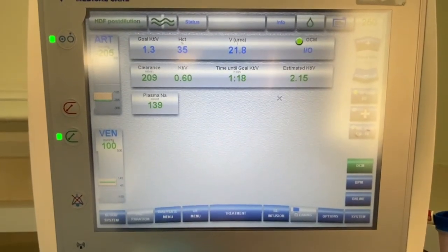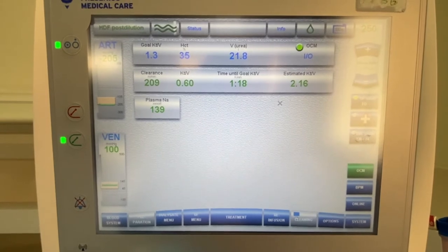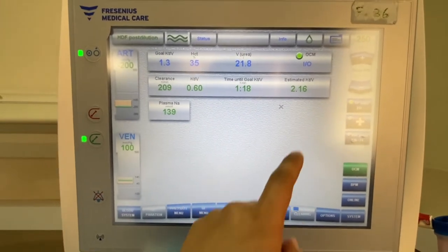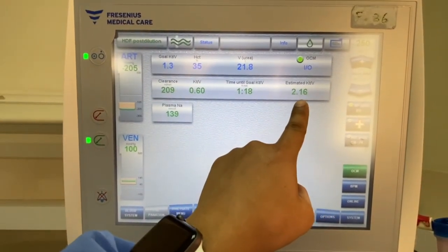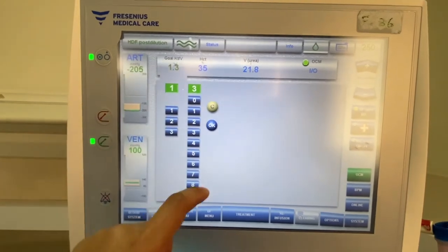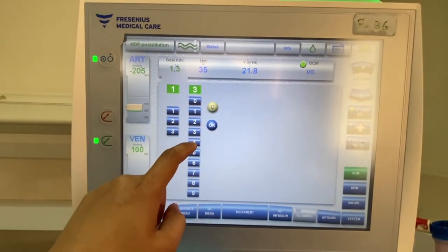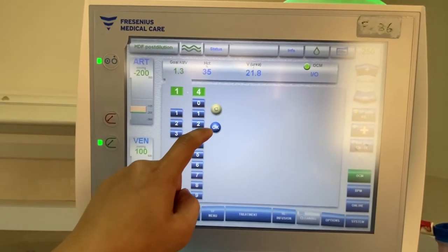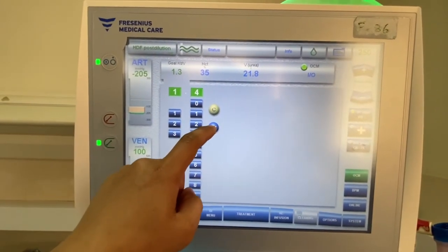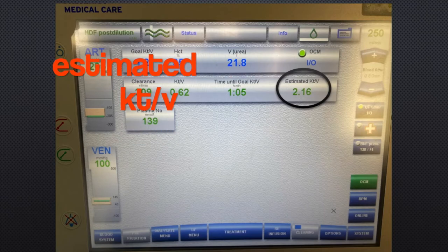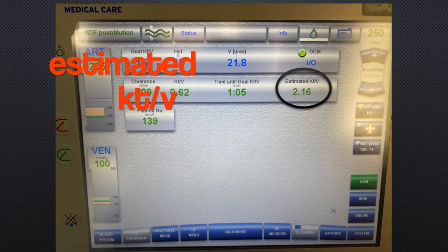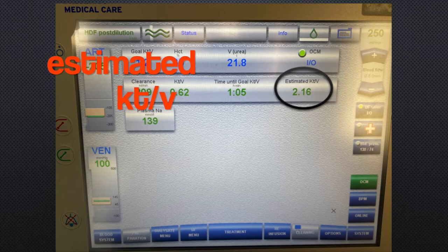You will be able to see the details for estimated KT/V compared to your goal, which you can set between 1.2 to 1.4. After setting up the Online Clearance Monitoring, the machine will provide values for estimated KT/V.